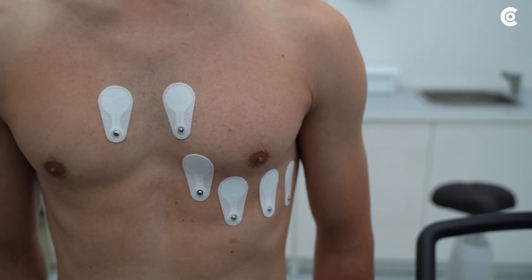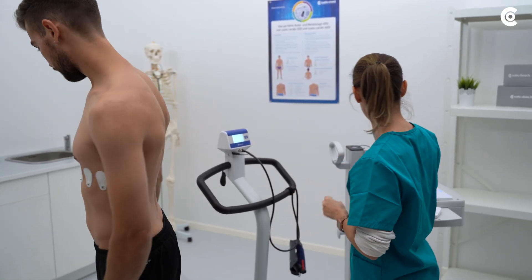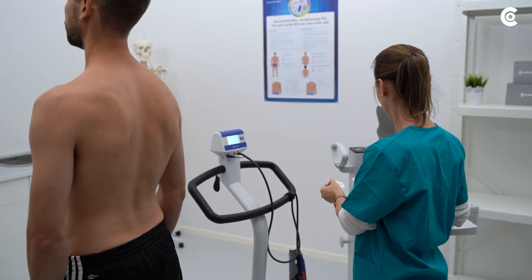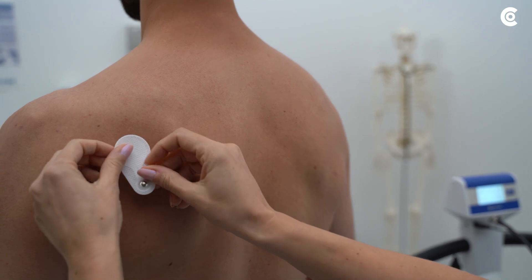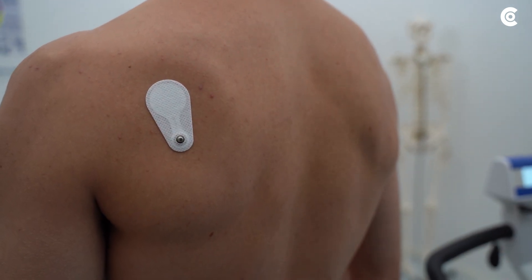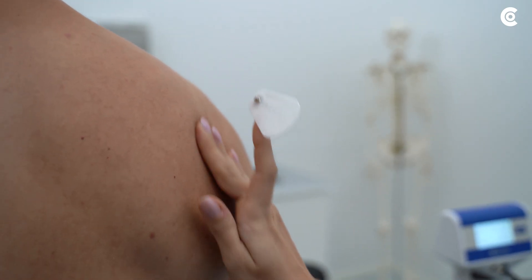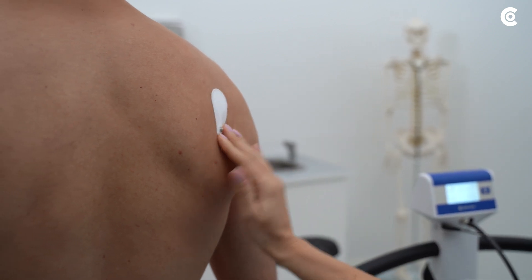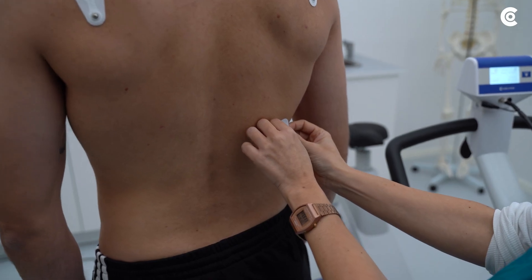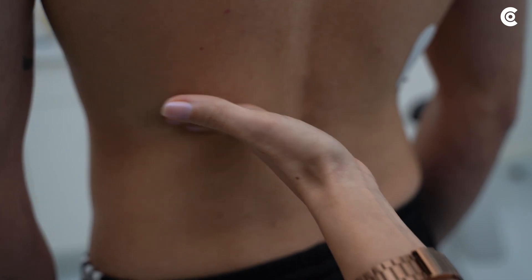The electrodes for the limbs are positioned on the anterior or posterior thorax with shortened cables. We recommend placing them on the back because there is less movement than at the front of the thorax. Electrodes L and R are placed on the posterior deltoid muscle left and right. Electrode N on the 9th rib right and Electrode F on the 9th rib left.